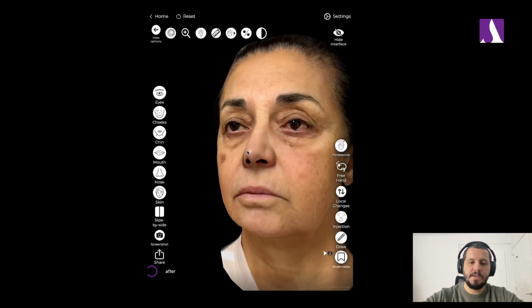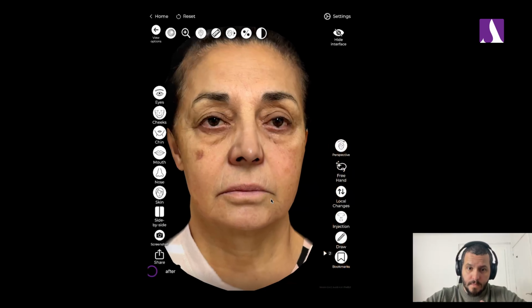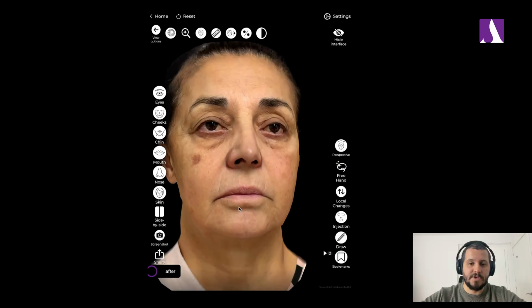So the secret here is to practice. What we always recommend is to decide what the most common procedures in your clinic are. Try them on a few patients that can be, for example, our friends or nurses or our relatives. Play with it a little bit and then start to use it with as many cases as possible. In any case, if you need, you can contact us and we are going to provide a more detailed training about our tools.